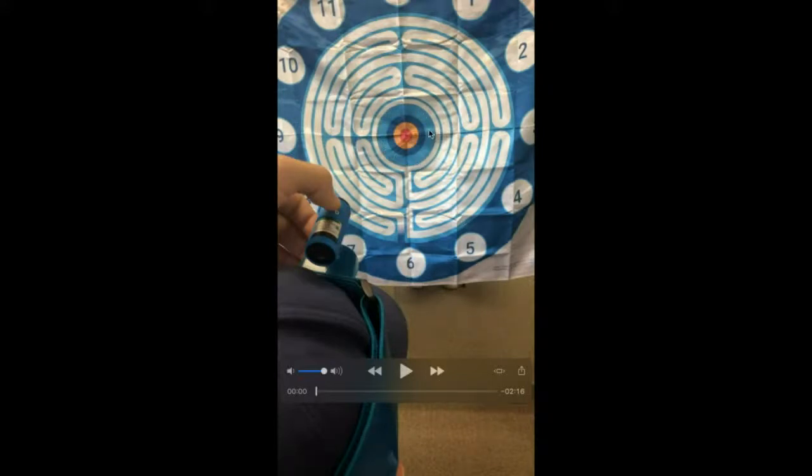Anything that's outside the target of this light blue circle here, this bullseye, is going to be outside the standard deviation, just by adapting it with simple math. Anything inside the blue field is going to be inside the standard deviation. So remember, we do between 1 and 3 pre-tests with eyes open. The literature is a little bit variable for that. But then we do up to 6 repetitions of eyes closed testing.